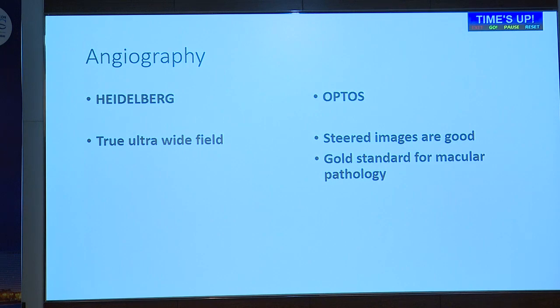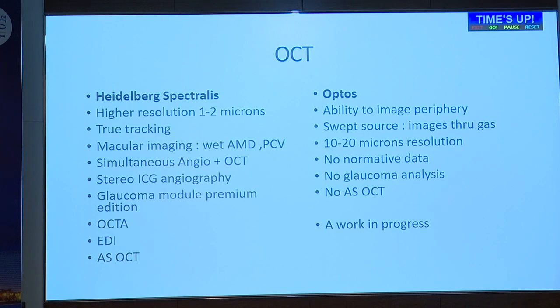This is some exchange of the headlines. And the Heidelberg remains the gold standard for macular pathology. If you want to study wet AMD or DME, even for the clinical trials, the Optos is not approved, but the Spectralis is approved because it provides very high resolution images and reliable images of the posterior pole. As far as OCT technology is concerned, I think the Optos is still catching up, and maybe in a few years' time they will be quite good.